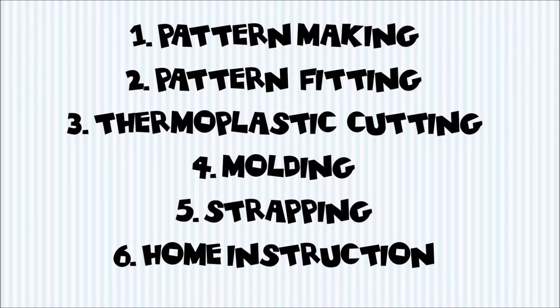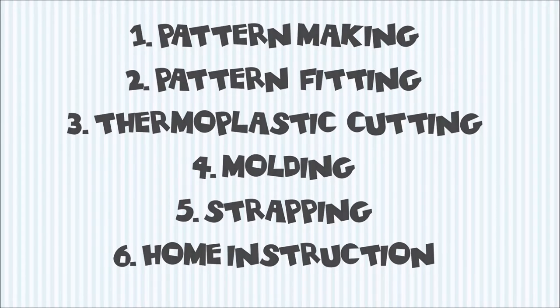Fabricating a resting hand splint has six steps. First, pattern making. Second, pattern fitting. Third, thermoplastic cutting. Fourth, molding. Fifth, strapping. And sixth, home instruction for orthotic care and orthotic use. Okay, let's start!